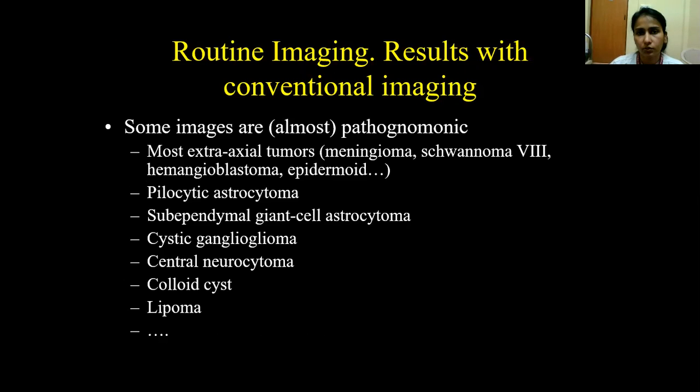Then we are going to results with conventional imaging. Some images are almost pathognomonic. Like if you see them, you'll know it as this tumor.